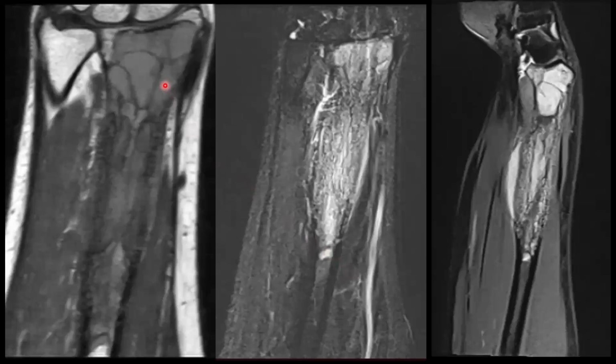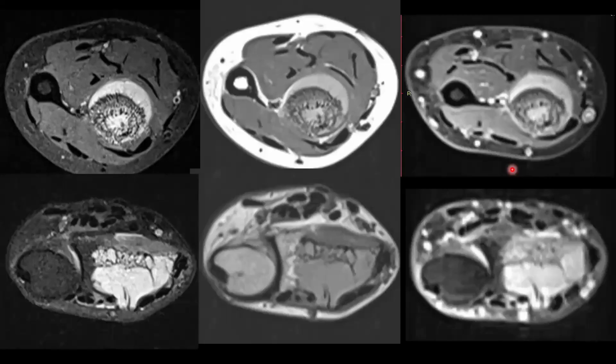So this patient underwent MRI. This is the T1 weighted MRI images. So expansion of the bones, T1 hypointense new bone formations. The PDFS shows involvement of the medullary space. Sagittal also shows involvement of the medullary space expansion, with minimal soft tissue components around the lesions.